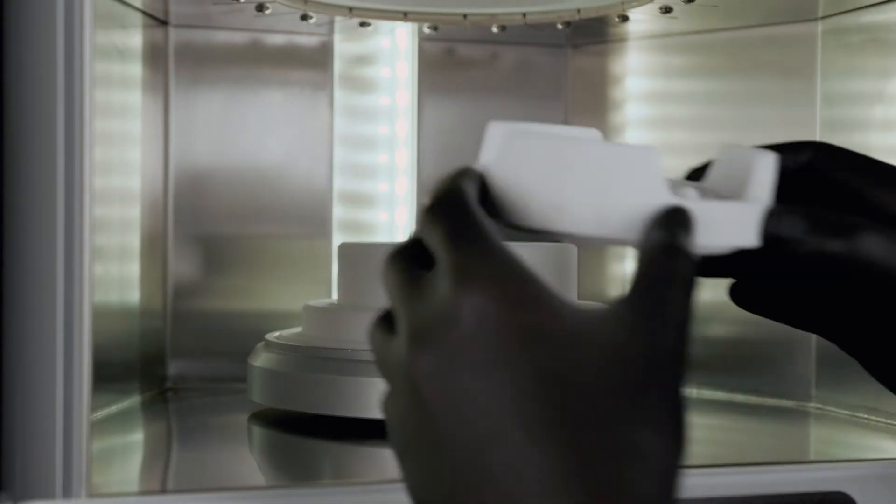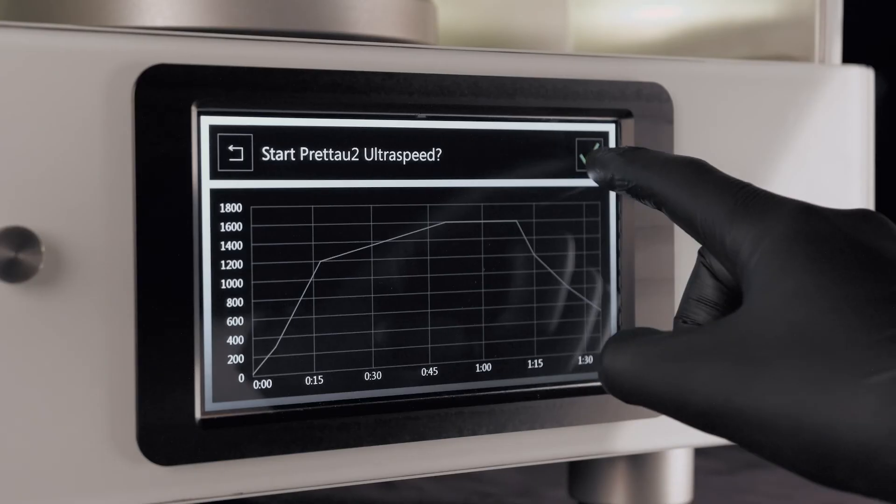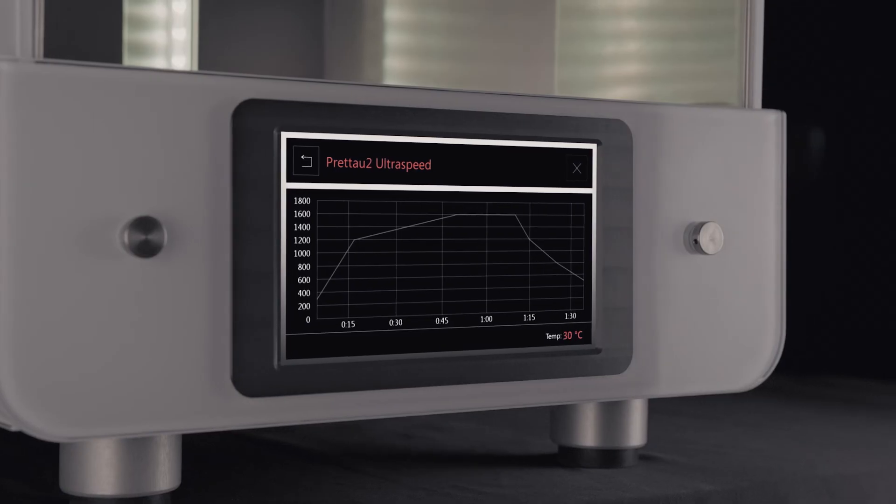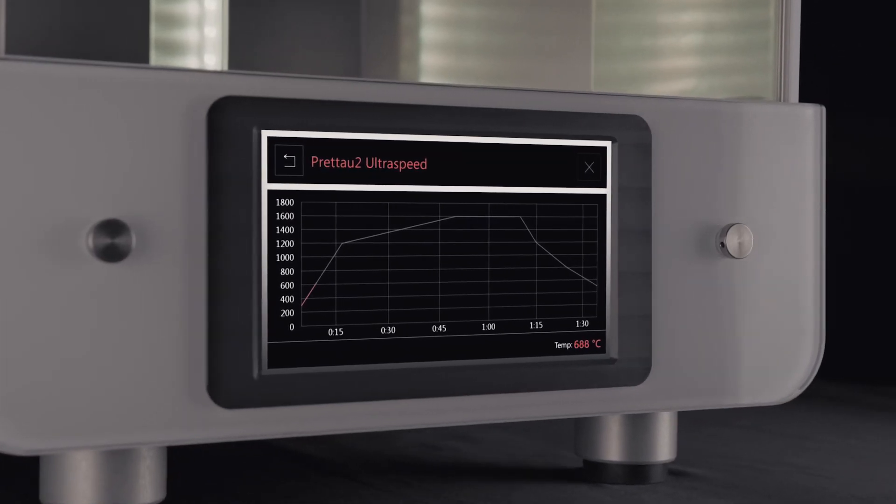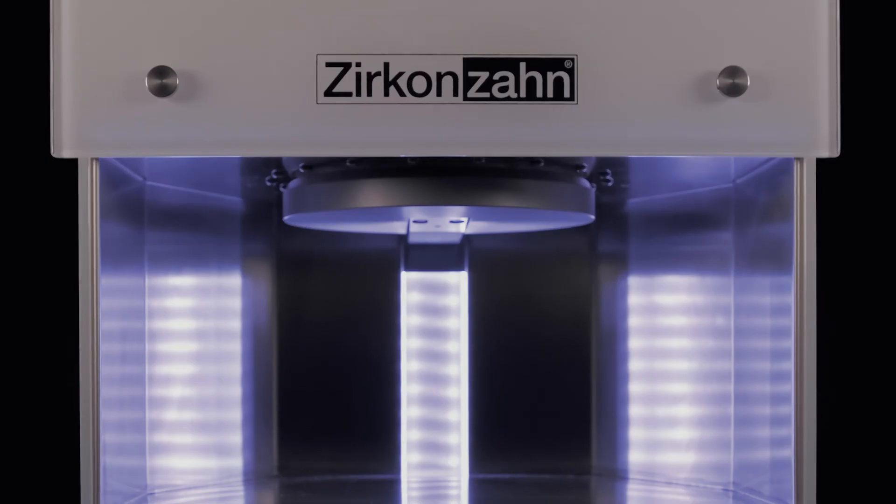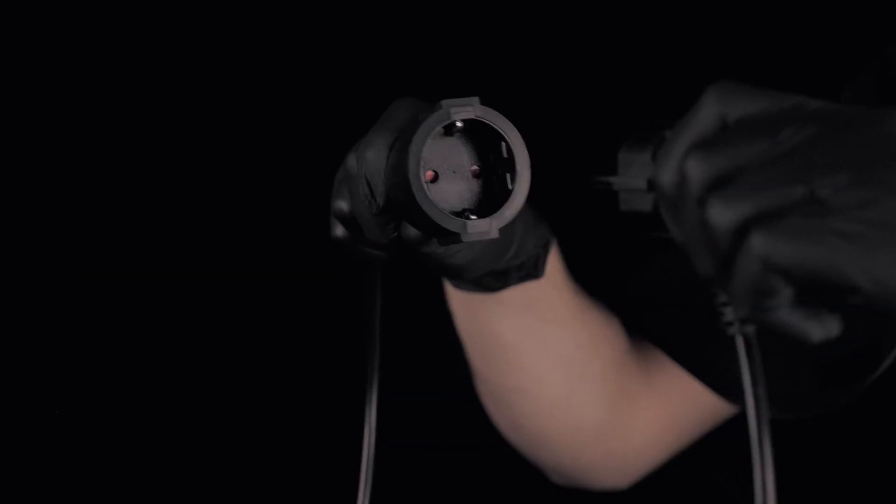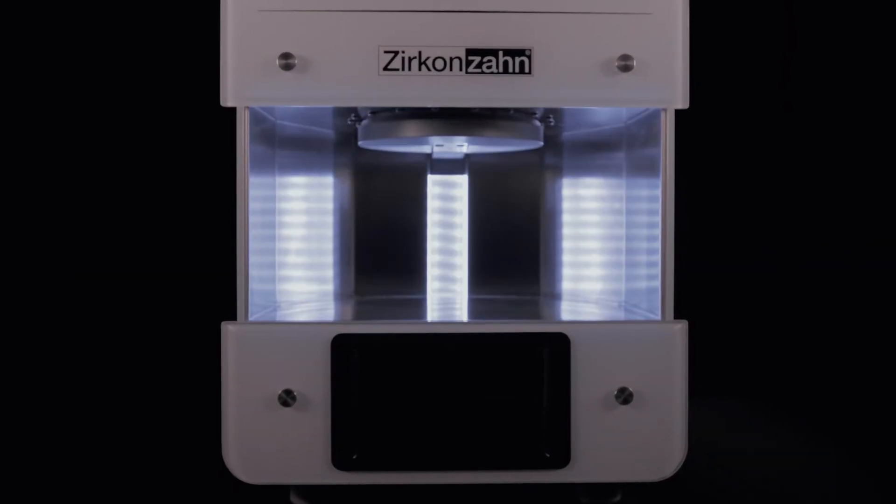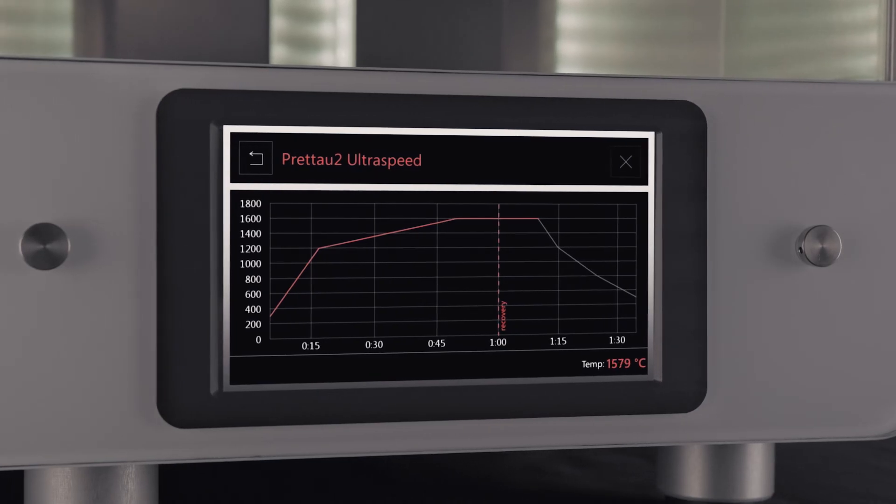But what happens if there is a power failure during a sintering cycle? With our new baking recovery function, it is almost impossible to achieve incorrect sintering results. After a power failure, the software checks whether the sintering program can be regularly completed without compromising the result or whether the sintering process must be suspended. If the program cannot be completed, the software will inform the user.